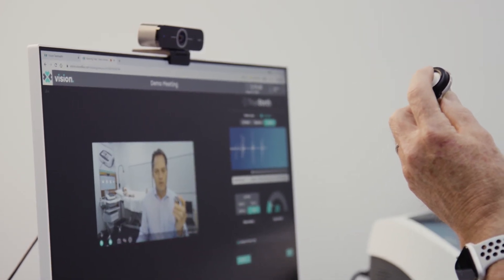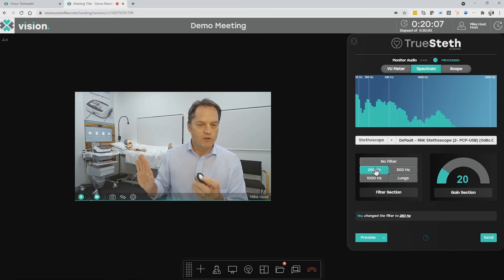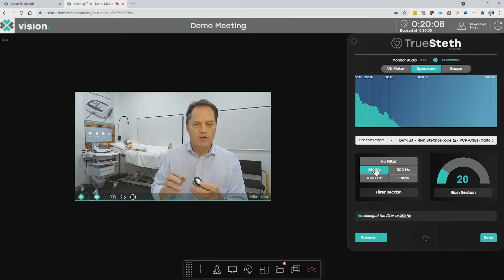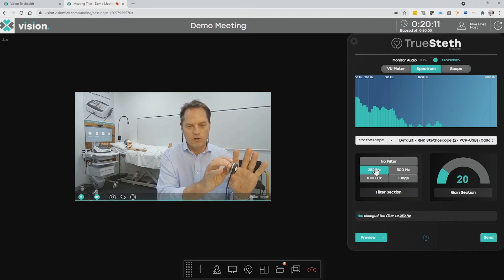Everyone in the call has control of these functions within the stethoscope, which means I can focus on the patient — I can apply the stethoscope to the patient and do what I'm told. All instructions can be given by the consulting physician at the far end, and I don't need to worry about controlling the PC.